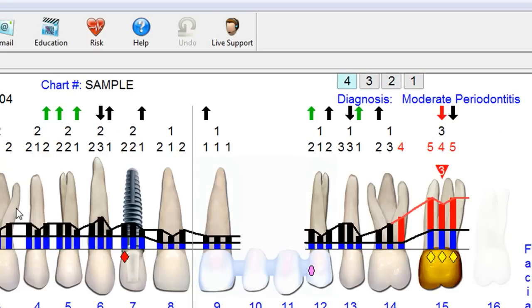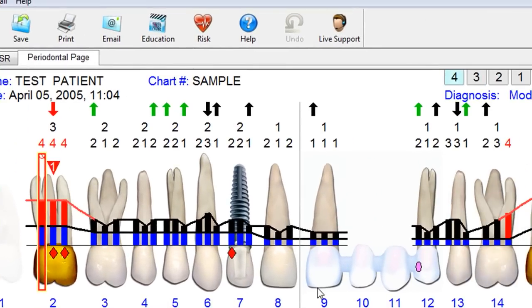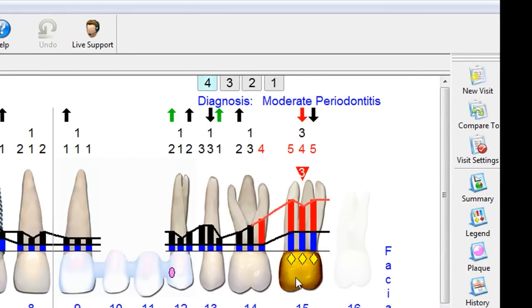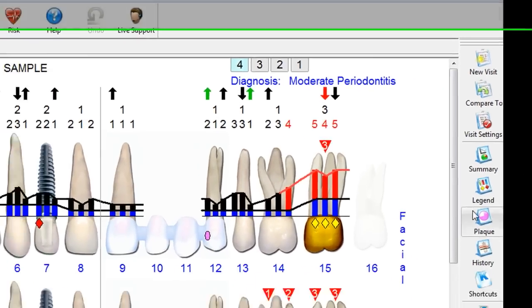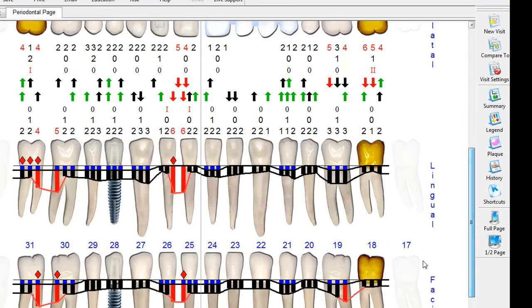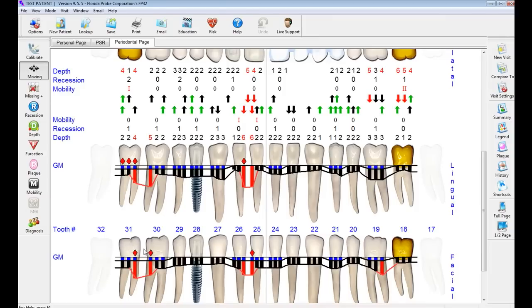Let's take a closer look. Tooth 1 is actually missing. Tooth 2 is a crown. Tooth 7 is an implant. Teeth 9 through 12 form a bridge, and tooth 15 is a crown. On the lower jaw, we can see a crown on 18 with an implant, and the wisdom teeth are missing.